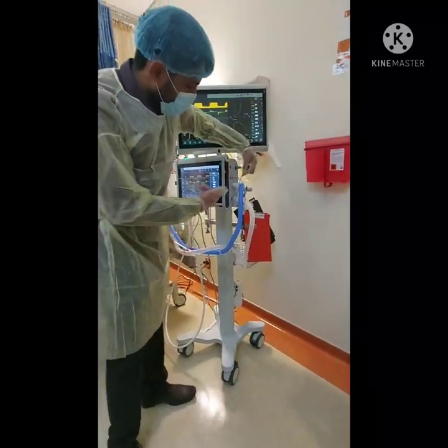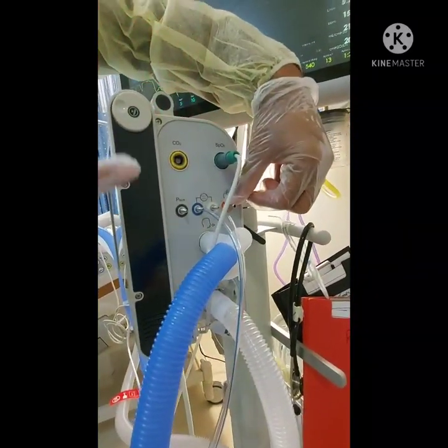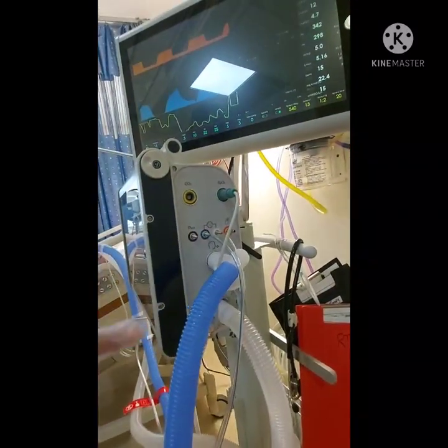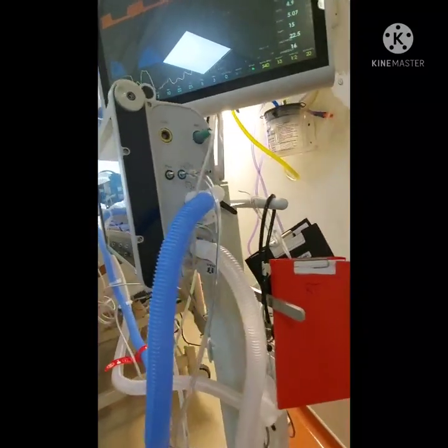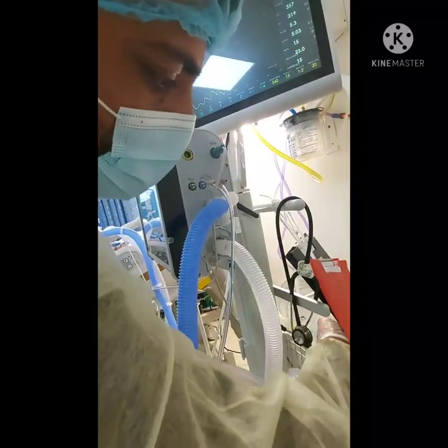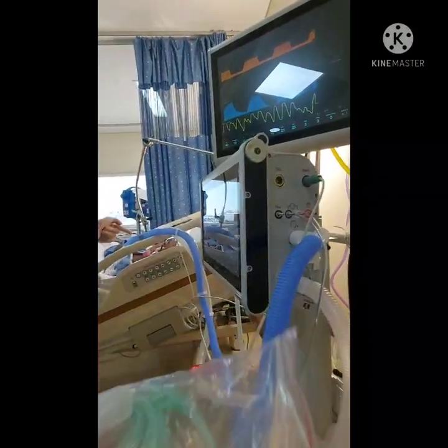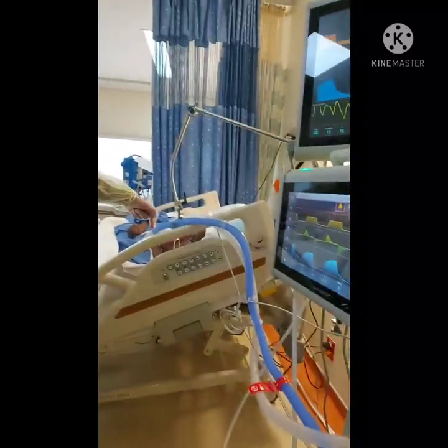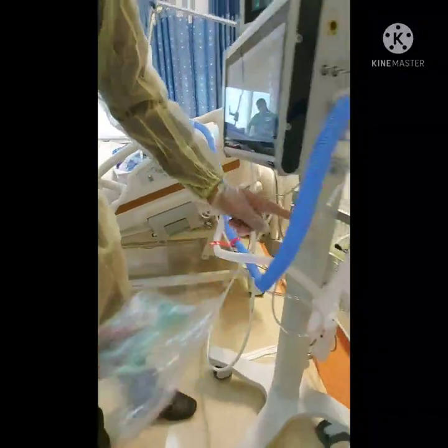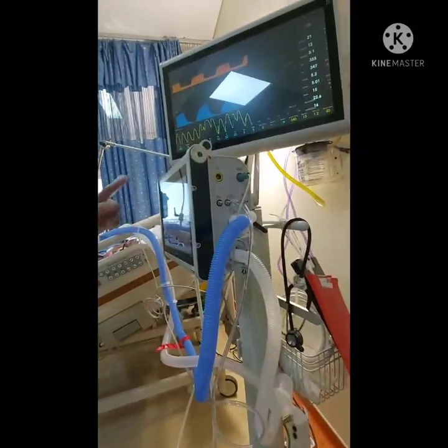Then you have the pneumatic nebulization here. We can give nebulization to the patient through the machine, so we can connect our nebulization. We also supply you the nebulization tubes. This is the tube, and this is the connector which you connect to the inspiratory. You can remove it here, then connect this T, and make a connection. There is one small beaker which you connect, and you can start from the menu.